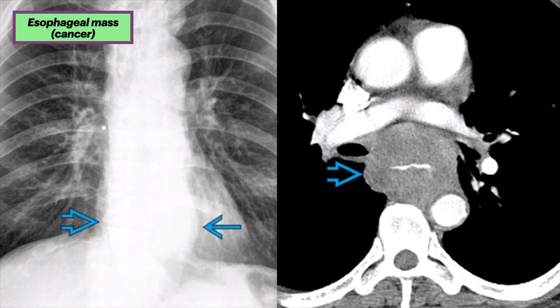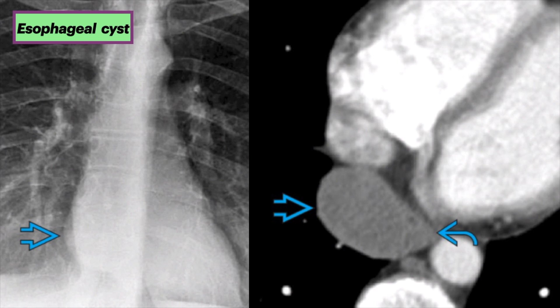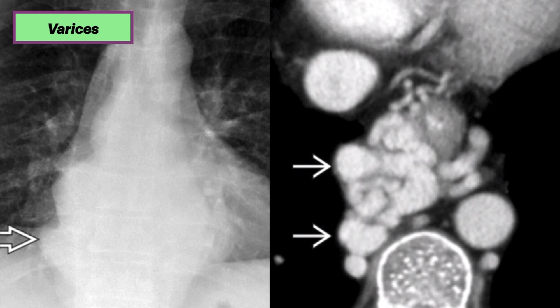Biopsy confirmed esophageal carcinoma. In contrast to the previous case, this one was benign. On the left is a chest X-ray of an esophageal duplication cyst. There is a subtle abnormal convexity of the lower third of the azagoesophageal recess. The corresponding axial CT shows an ovoid, water-attenuating mass in the visceral mediastinum, abutting the esophagus and consistent with a congenital foregut cyst. In this case, an esophageal duplication cyst was diagnosed, which may be indistinguishable from a bronchogenic cyst on imaging.